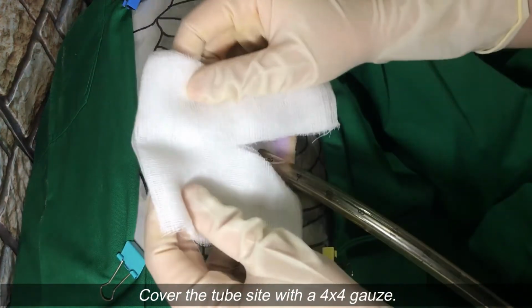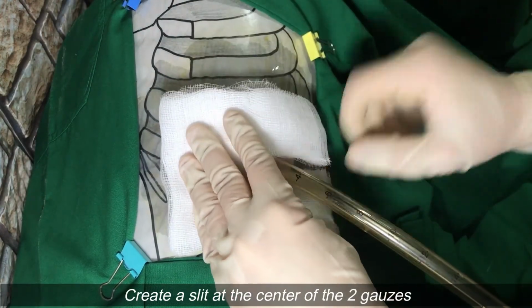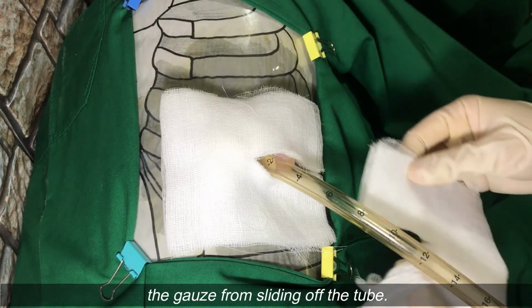Cover the tube site with a 4x4 gauze. Create a slit at the center of the two gauzes and then place them 90 degrees to each other to prevent the gauze from sliding off the tube.